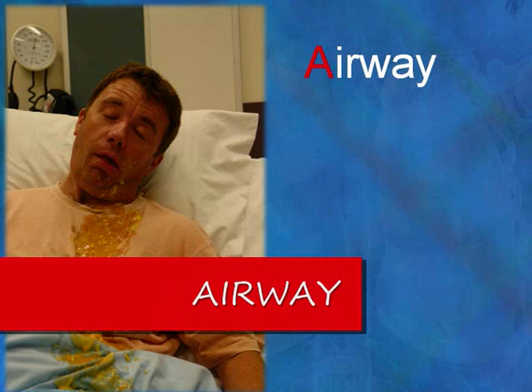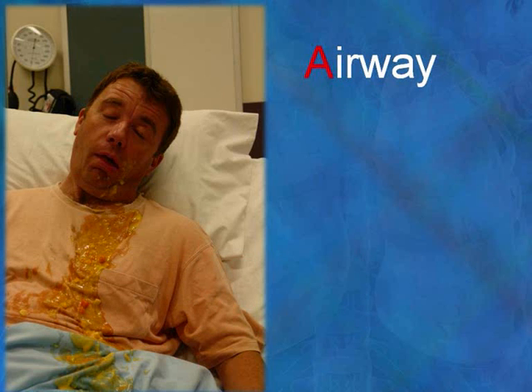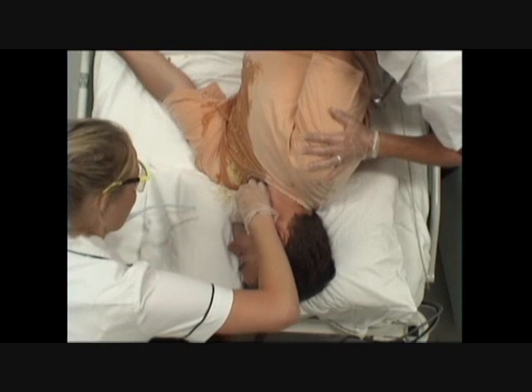When assessing your patient's airway, firstly check for visible signs of obstruction, and in this case, we can see that our patient is obstructed with vomit. You will need to familiarise yourself with the signs of a compromised airway. If your patient is able to talk, then their airway is, by default, patent. Suctioning is indicated for patients with any occlusion.